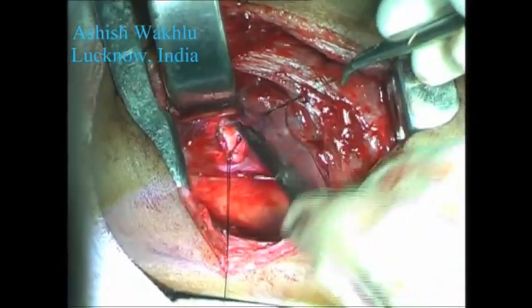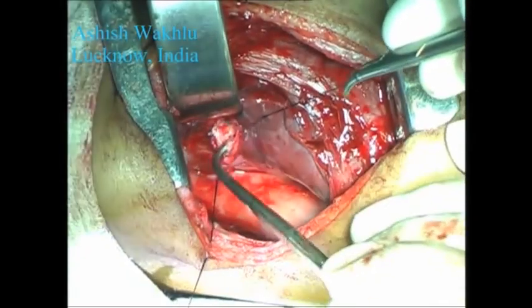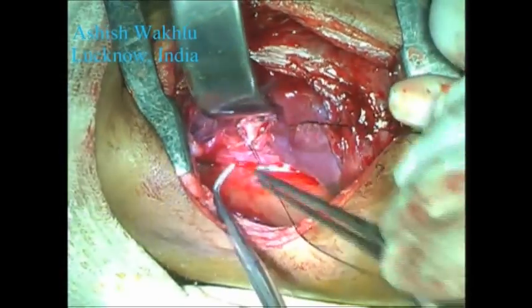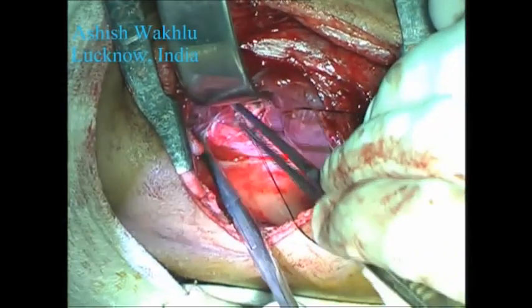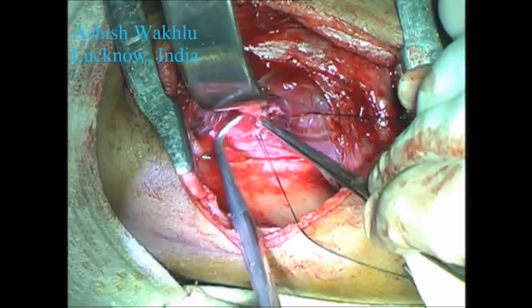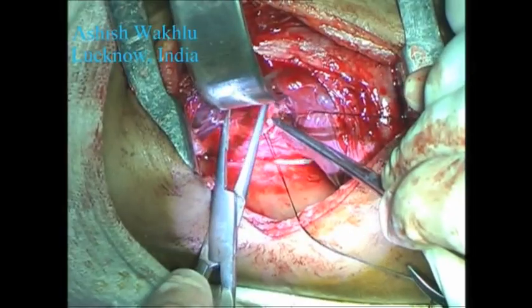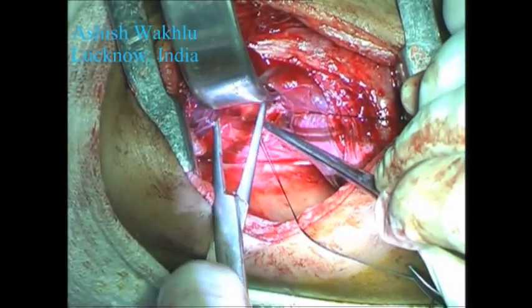There you can now clearly see the upper and the lower bifurcations at the hilum of the right lung, and this is where the anastomosis will be performed to the stump of the right main bronchus on the tracheal side.